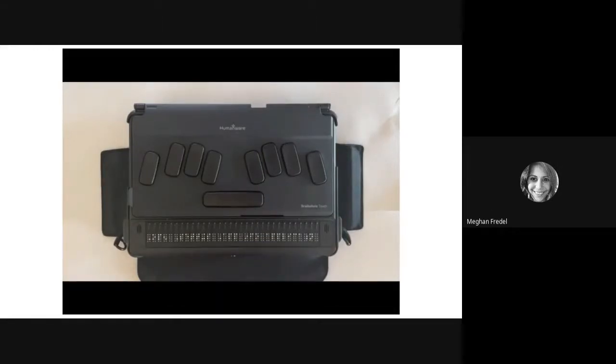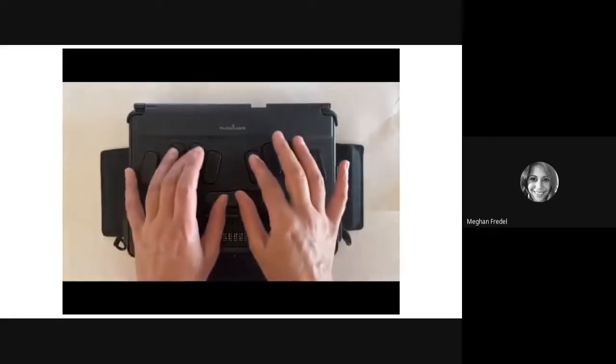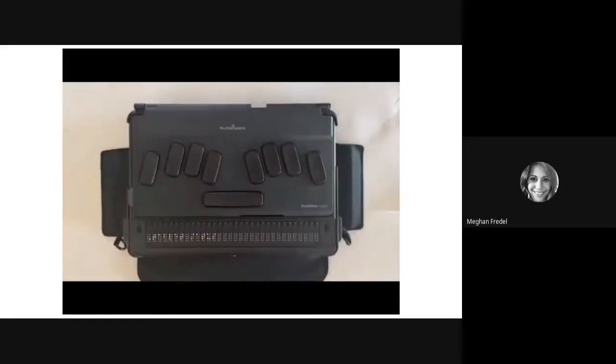Then finally, I want to demonstrate the system information command. Main menu. And so, Contacts. The system information command is a space plus I, and basically it's just going to give you a bunch of different information about your unit and its system. Tablet status. Status of the battery, network, and other information.